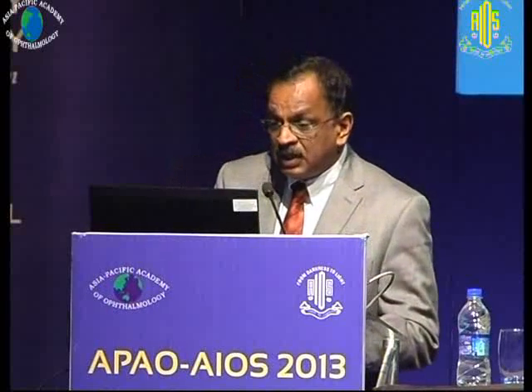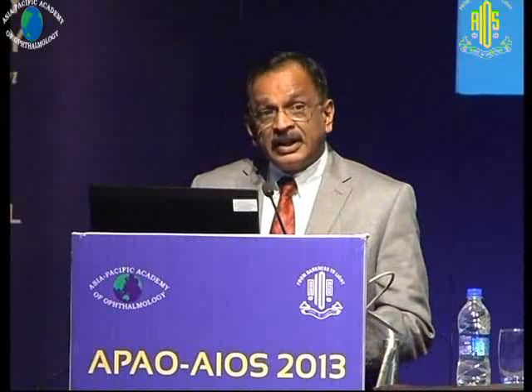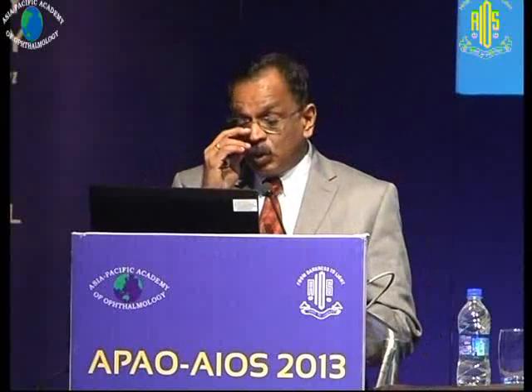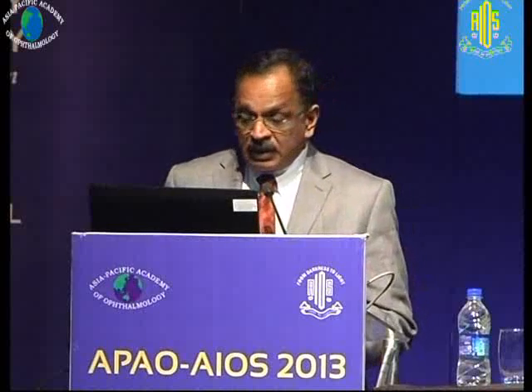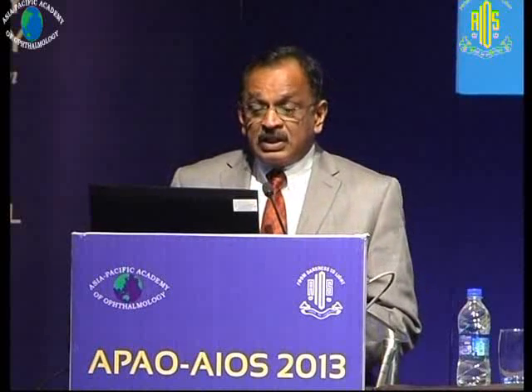In these situations, you would have to do what we call relaxing retinotomies, and the next indication is the access retinectomies or retinotomies you would do to go under the subretinal space for removing fluids or tissues. As I said, it's done in a pathological site of the retina.